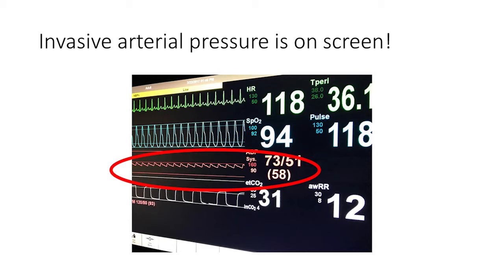And I think the other key part of all of this, obviously, is that we often see with simulation training that our fellows will say things like, everyone stop, we need to check the pulse. And actually, you don't need to do that in a cath lab. You have invasive pressure measurements. So in fact, all you need to do is stop and look up at the machine, and you can see the readings, and you can see exactly what's going on in terms of whether that person now has output, and what's going on, obviously, with their ECG as well.